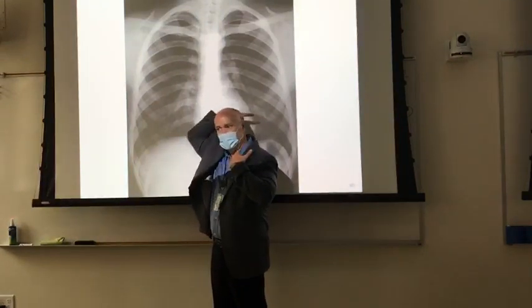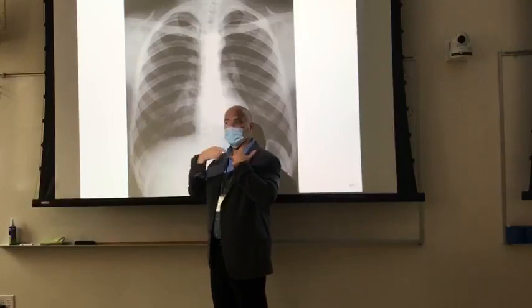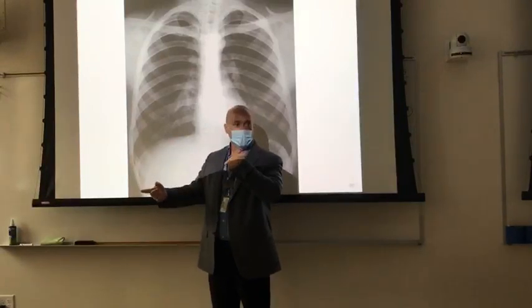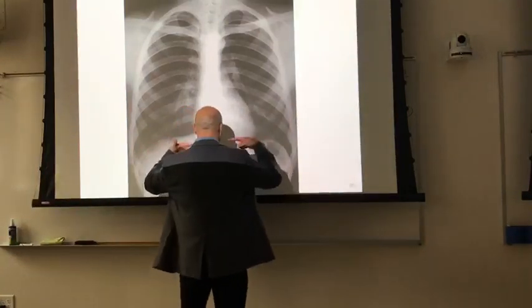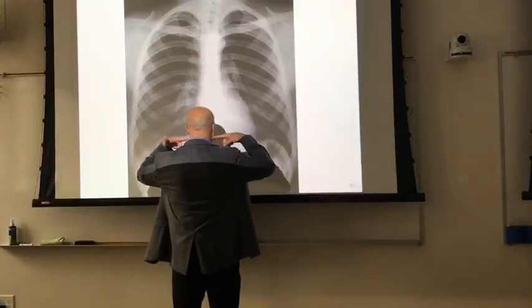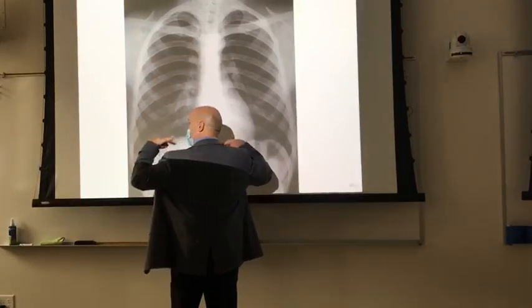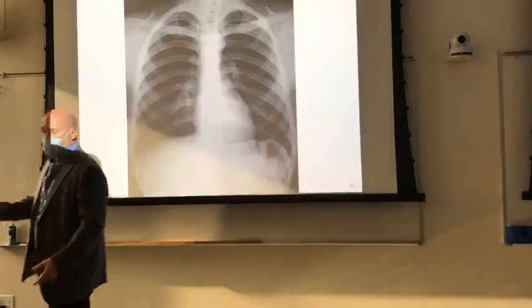That way, right? As opposed to my clavicles going this way. So what's going to happen is this clavicle is going to be out in the middle of nowhere, and this clavicle is going to be over the spine. Okay? So if I go PA, it's kind of the same thing. Clavicles right here, right? So if I rotate, then this one's over the spine, this one's out in the middle of nowhere, right? So we want to look for rotation.